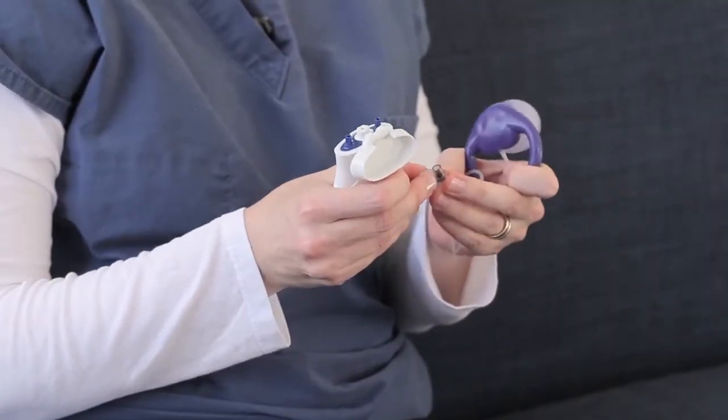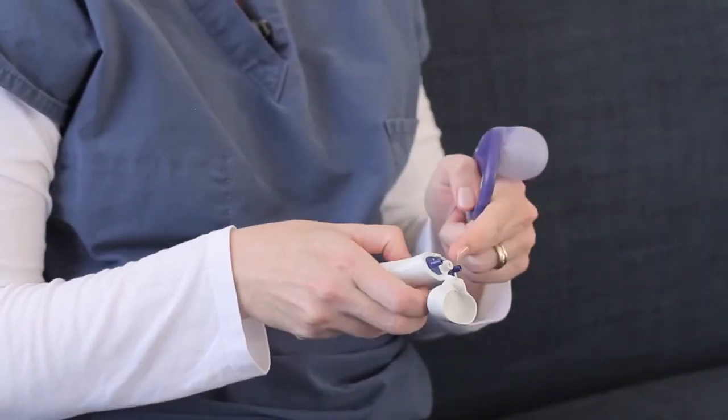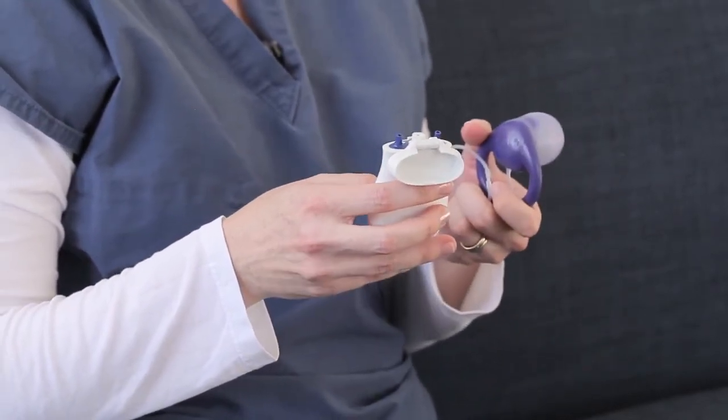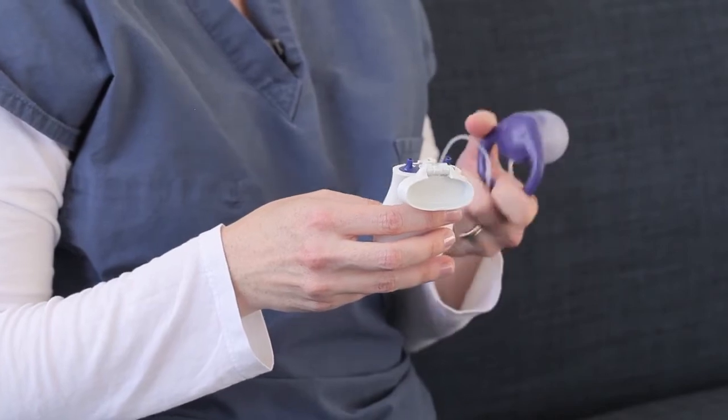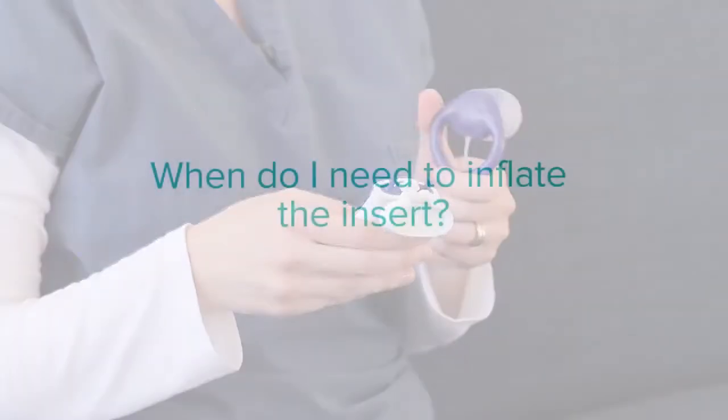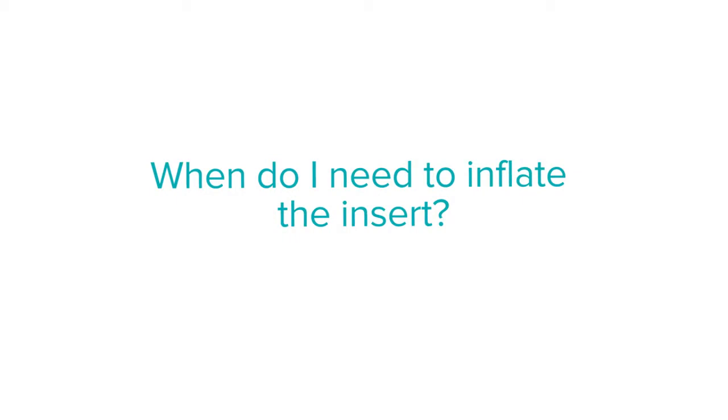The pump has a regulator, which is a safety mechanism that does not allow the balloon to become overinflated. So you could keep pumping it up and extra air will actually come out the regulator instead of going into the balloon. You're going to want to inflate the balloon after you have a bowel movement and a few times during the day in order to make sure it has plenty of air.